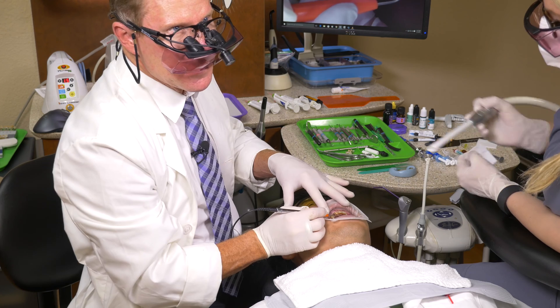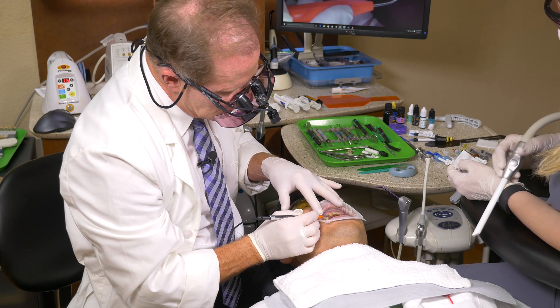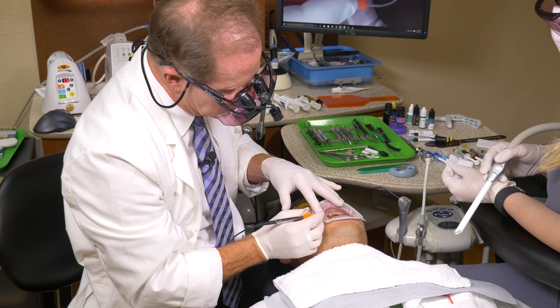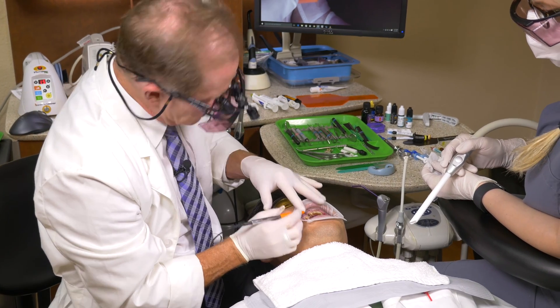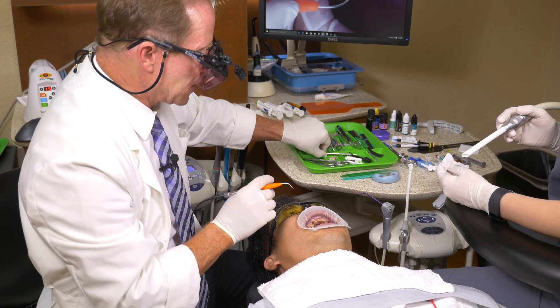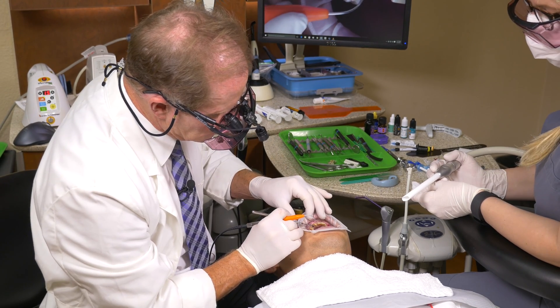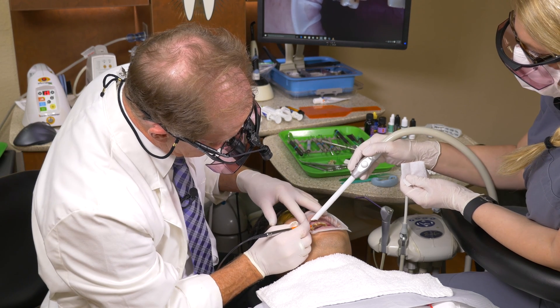Facially, I'd like to bring the zenith or the apex of that tissue up to where I'd want that canine to be, which would be a little bit higher than the lateral. So we look good there. Let's go ahead and take our periodontal probe — again, we need one millimeter. We're at about two. I'm just going to clean things up a little bit. I like the depth; I like the diameter.